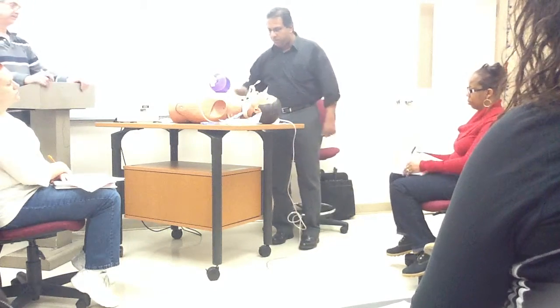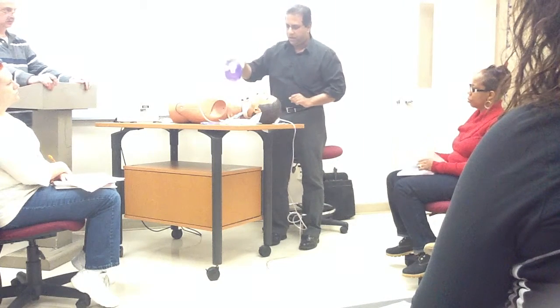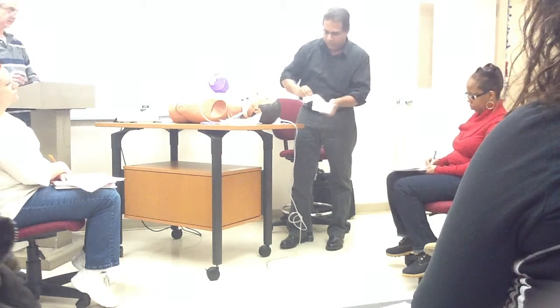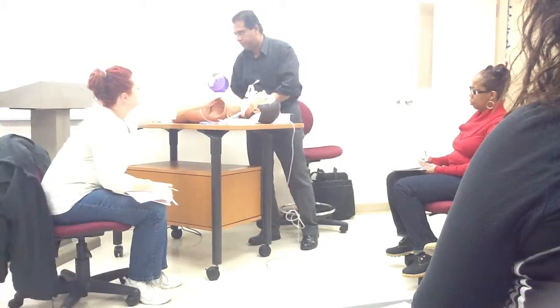Okay. So, you silence the ventilator, you take him off the ventilator and ambu him. Before that, you have to get this thing ready. This step is pretty much the same as what we showed you last week.